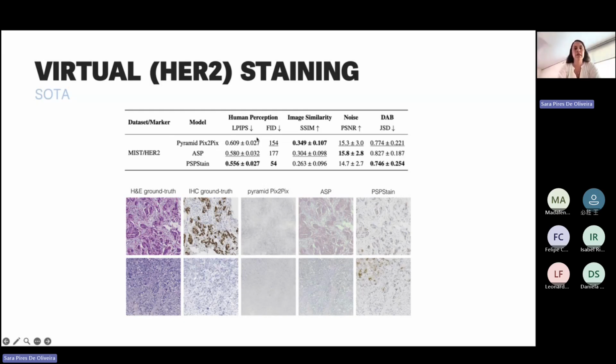what the global images look like to us. Also, we compute another distance, but this time only at the, so basically we have two colors here. We have the blue and we have the brown. The blue is still hematoxylin, the brown is DAB. It's just a precipitate, so a molecule.